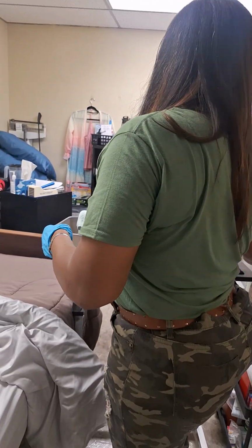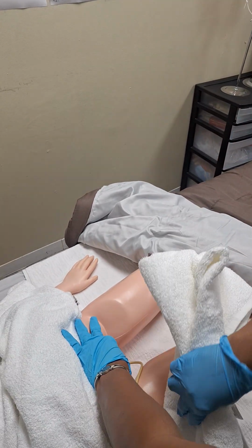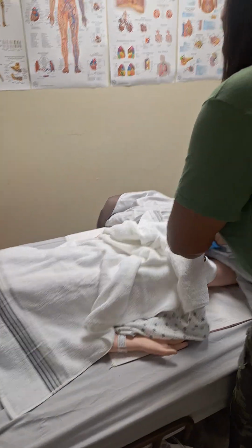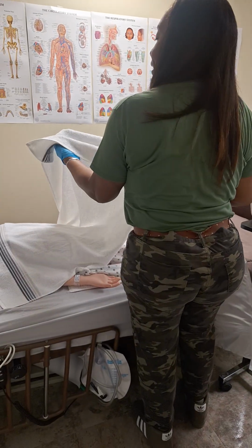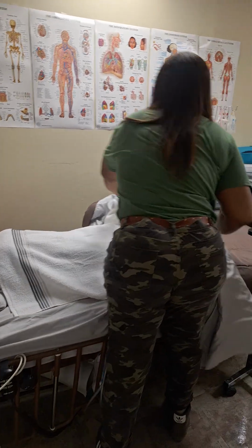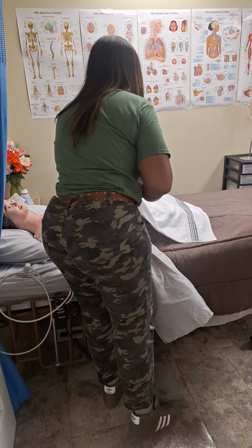I'm going to take my towel and pat dry the catheter. Now that I've dried the catheter, I'm going to take and pull Miss Allen's gown back down. Again, I'm not touching Miss Allen. Now I'm going to take the inside of my blanket, my towel that I'm using as a warming blanket, and I'm just going to pull the cover back up over Miss Allen. Not touching her covers, not touching anything.